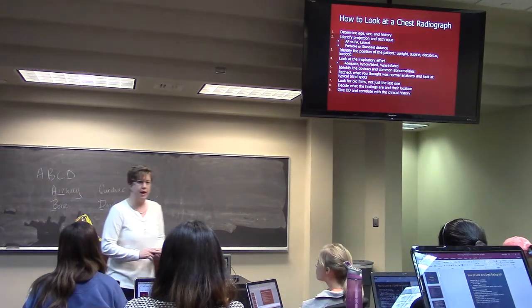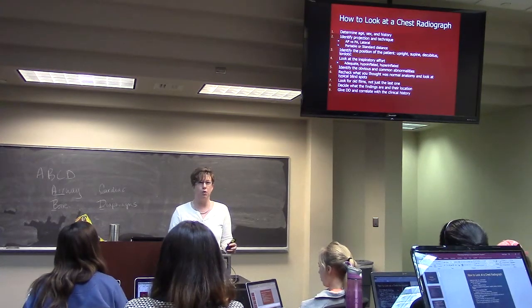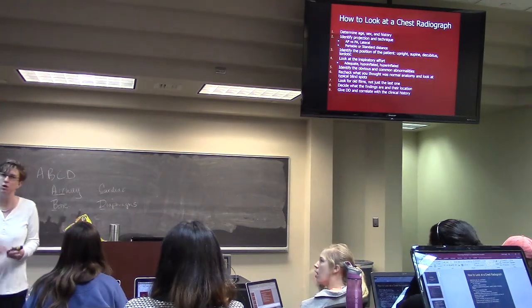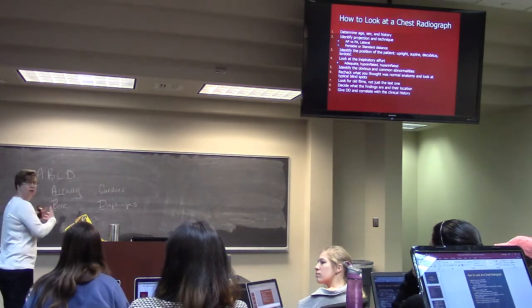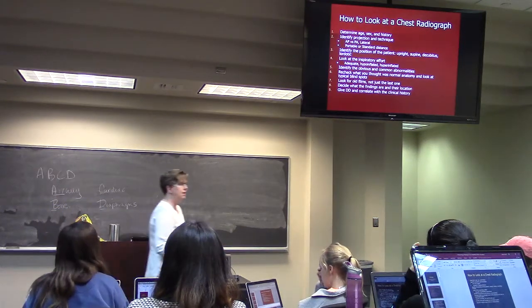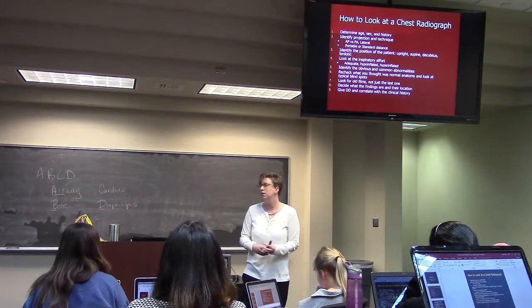And you know which way an x-ray is taken of the chest? Did you talk about that? Right? So normally, for someone who's coming in for an x-ray, we get a PA. And you understand how that's shot, right? Through the P, the posterior, and the anterior is projected into the x-ray. That gives us our best image. So someone who can stand up, we want them to be standing.